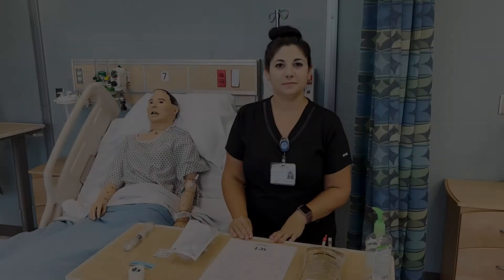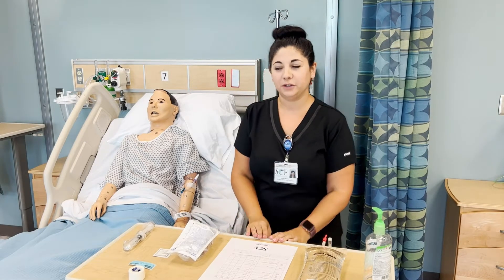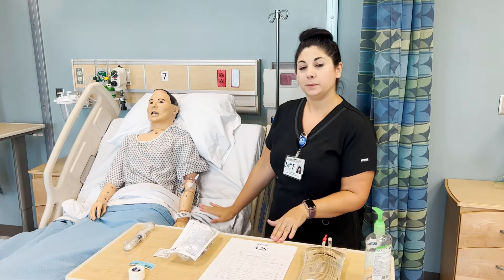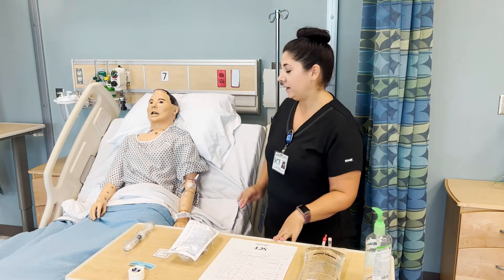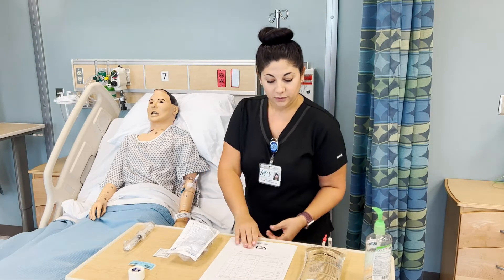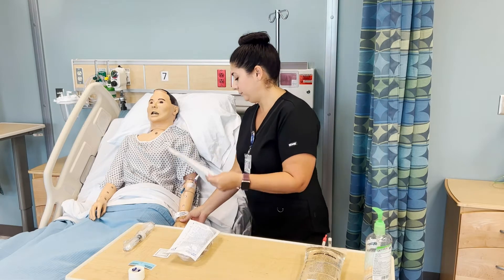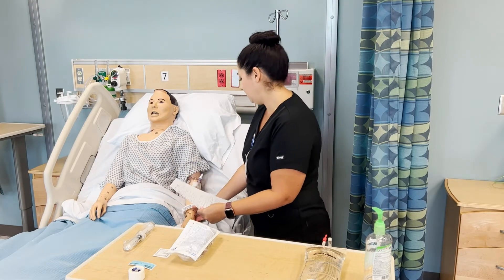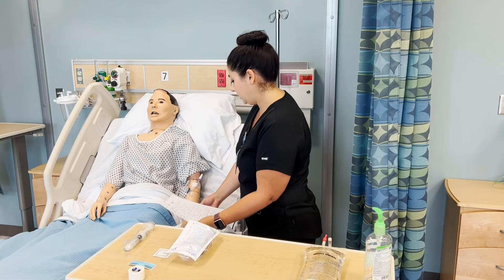I am now going to take all this to my patient's room. I have knocked on my patient's door and entered, introduced myself, and explained to my patient what we are going to do. I've also raised the bed and dropped the side rail so I have better access to him. We're going to verify his name and date of birth, bringing my MAR to the bedside. Can you tell me your name and date of birth, and do you have any allergies?